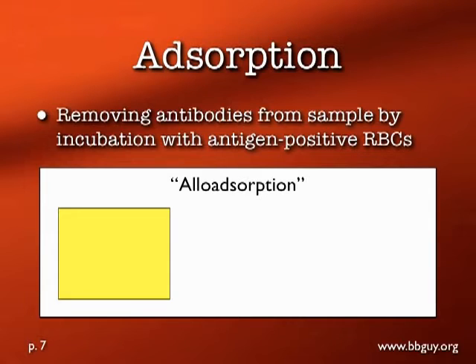Again, let's go hypothetical. Let's imagine we have someone who has an anti-big K, an anti-big C, and an anti-big S. And when we're doing our testing, we kind of know that there's some stuff there. We can identify the anti-big K and the anti-big C, for example, but we're not sure. It seems like there's something else there, and we want to figure out what it is.